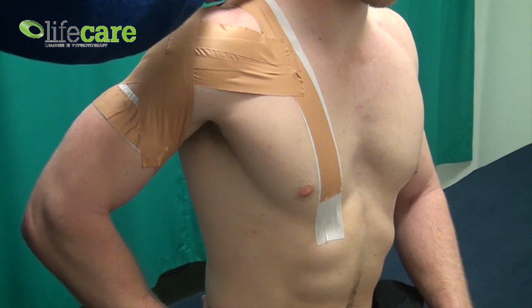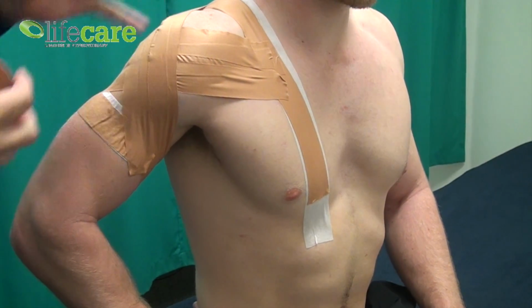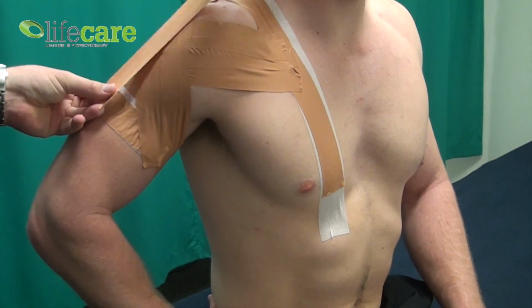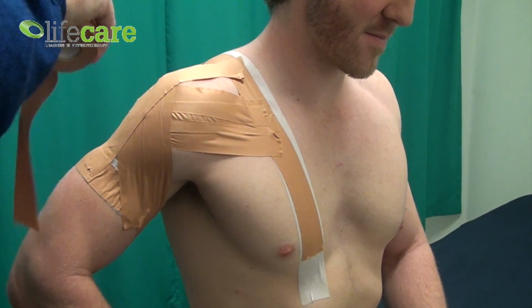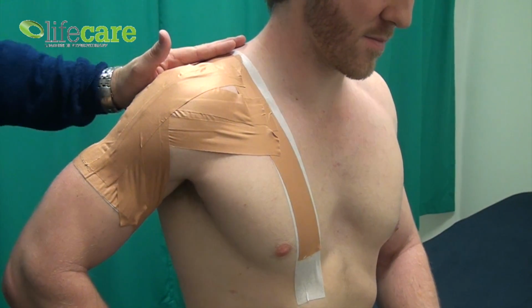And laid down nice and firmly. From there, I always find it beneficial just to do a couple of strips just to lift up, to feel like we're locating that joint back into its cavity. So it becomes 1 here. Always careful not to punch the person in the face when you rip the tape. So that's the baseline of an anterior dislocation tape.